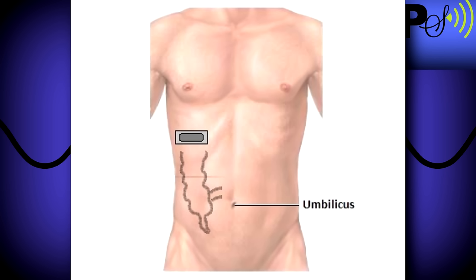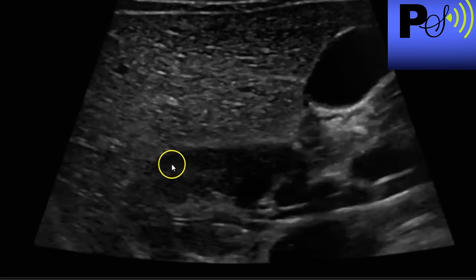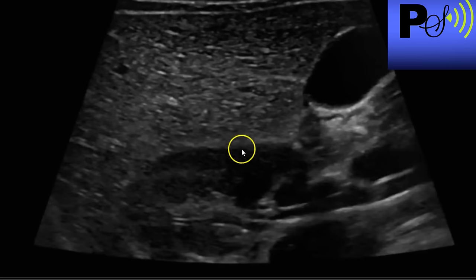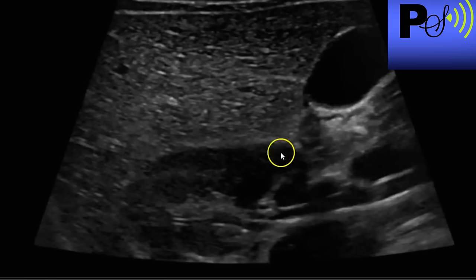Typically we begin with the right upper quadrant. We like to look at the gallbladder since it's right up there — make sure there's no stones. We look at the right kidney and the liver, and make sure there's no fluid in Morrison's pouch. If there's a ruptured appendicitis you might get fluid up there.